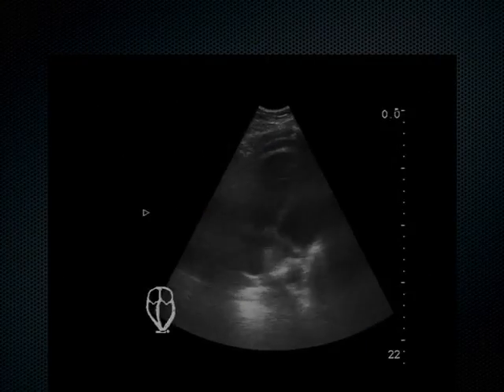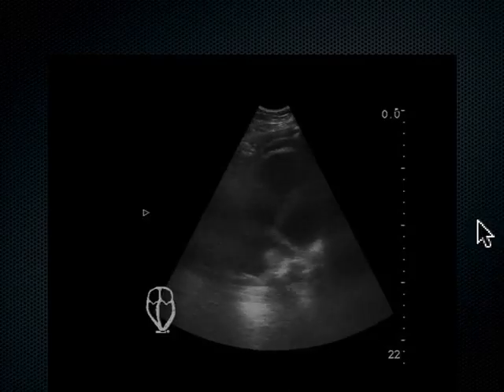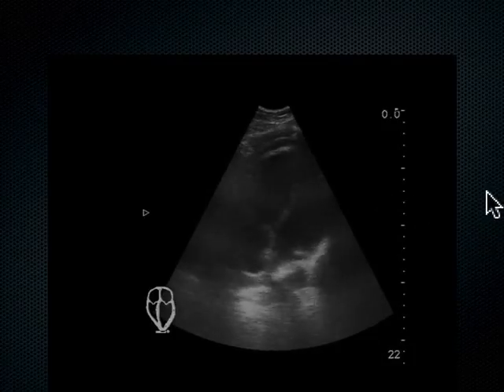This was an employee of the hospital who had an external fixation device on his leg, a 41-year-old male. He went home after orthopedic surgery. Two days later, he came back in full-blown cardiac arrest, PEA. We're doing CPR on him, and we saw his heart with no pulse. Now, about 30% of the time, you don't feel a carotid pulse, but you actually see this amount of cardiac activity. So this is called PCM, pulseless cardiac motion.